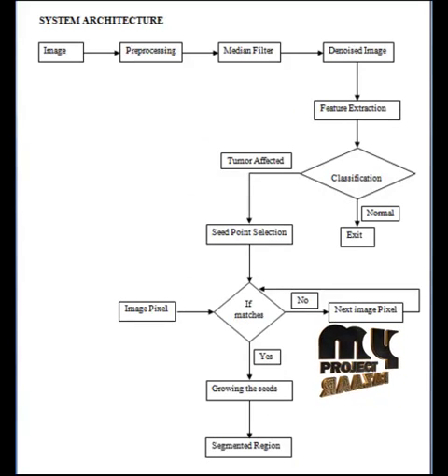Let me discuss the flow of the process of automated fiducial localization in CT based on surface processing and geometrical prior knowledge for radiotherapy applications. Initially, the CT images obtained were pre-processed. Pre-processing is used to remove the noises from the image. The noise refers to the unwanted pixels in the image. The noisy pixels reduce the quality of the images, so it is necessary to remove the noises from the image.